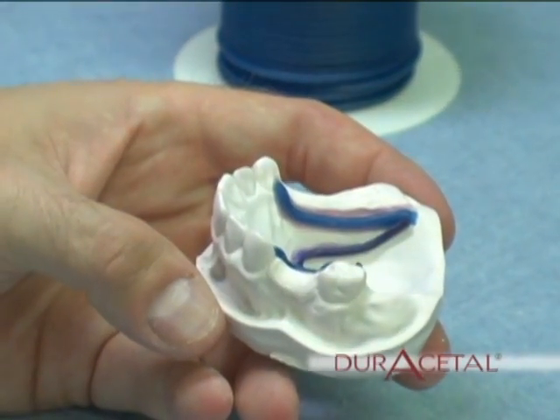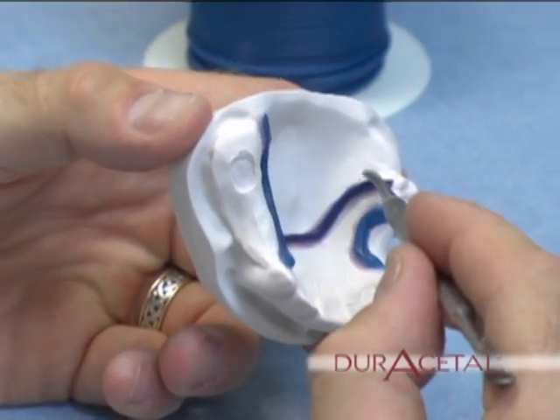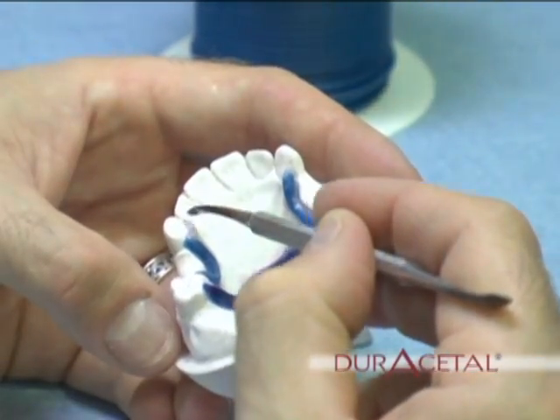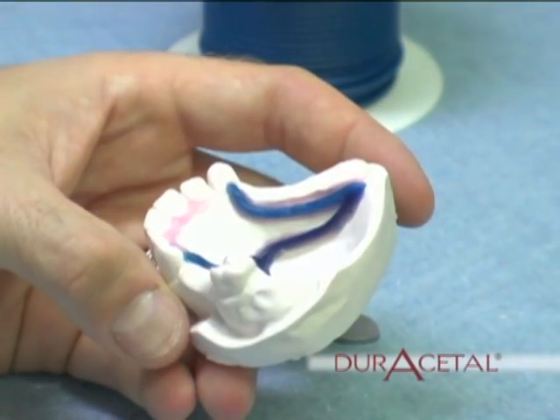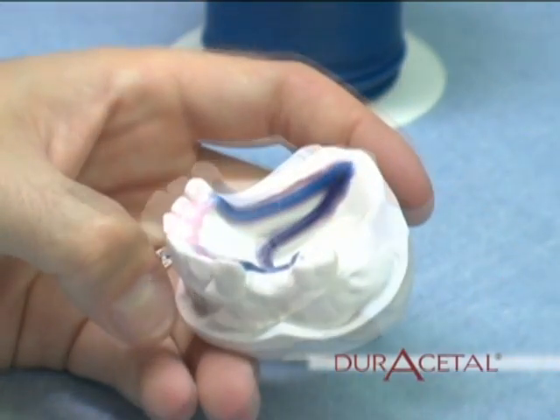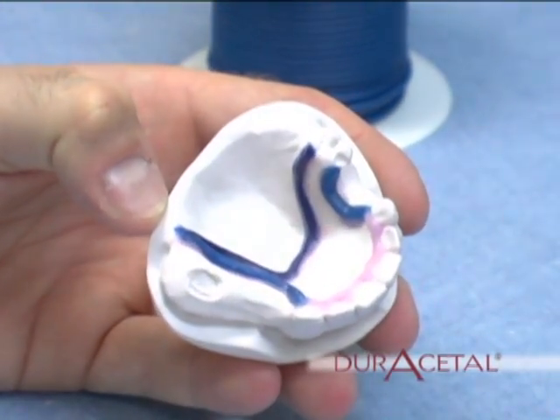Creating the major connector. Place 12 gauge sprue wax along the lower half of the major connector and seal it down onto the model. Using your waxing instrument, put a bead of wax along the anterior area of your major connector. Now you have created the borders of your partial. Using heated wax or a sheet of base plate wax, fill in between the borders and also fill in the saddle areas. There is no need to make retention in the saddles now.